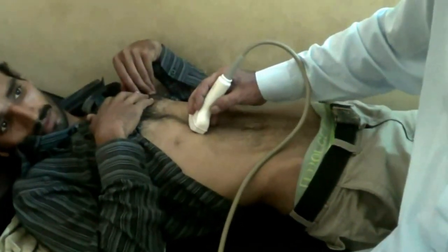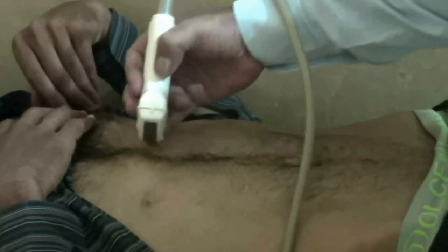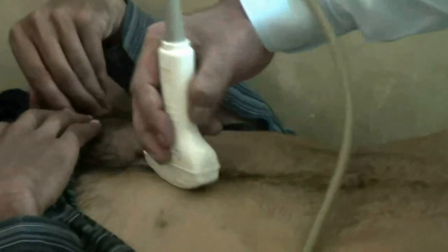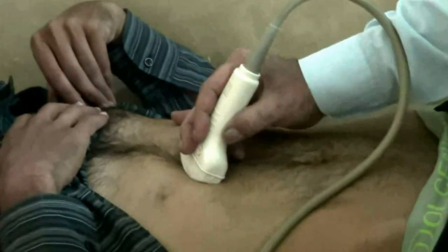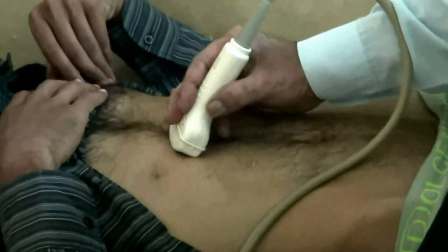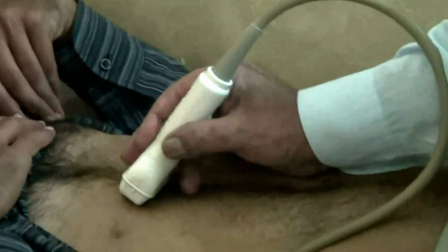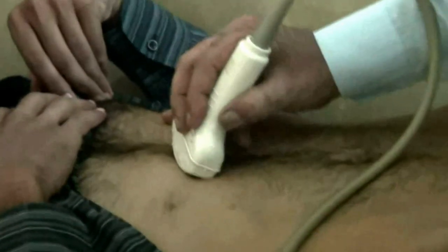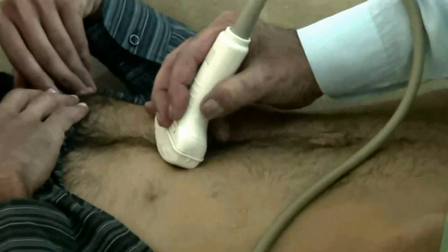Normally when we scan for the hepatic veins, the marker is on your right side. You maneuver the probe keeping it at the xiphoid process, a little higher, and then maneuvering it in this way to see the hepatic veins from this angle. I am high up in the region of the xiphoid process, hanging the probe at about a 60 degree angle, and we can see the hepatic veins.